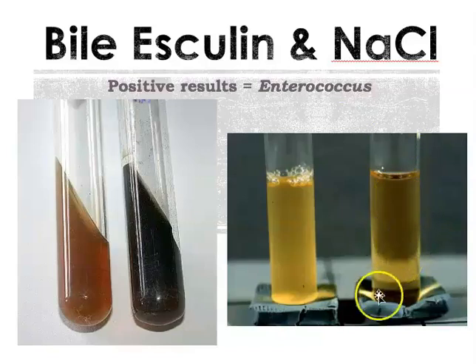We inoculate the broth, the liquid. It'll incubate overnight, the same amount of time that your bile-esculin does. When you come back the next day, you're looking for cloudiness, which is an indication of growth, which means that the organism is able to grow in that increased salt content. So that is a positive result. Clear, or no change in turbidity, is negative.